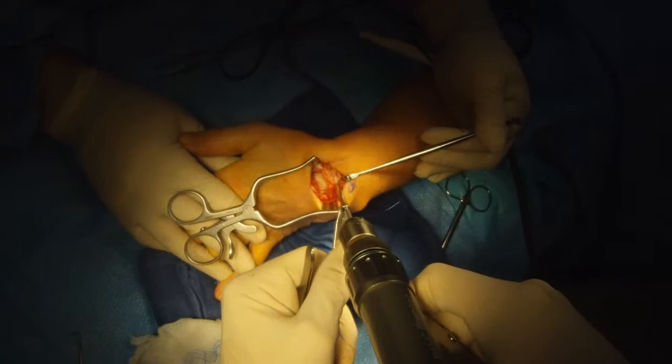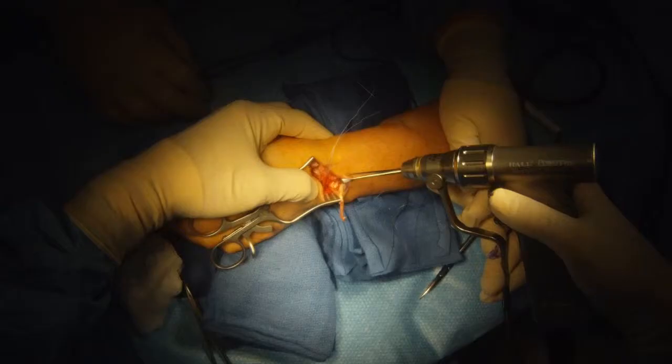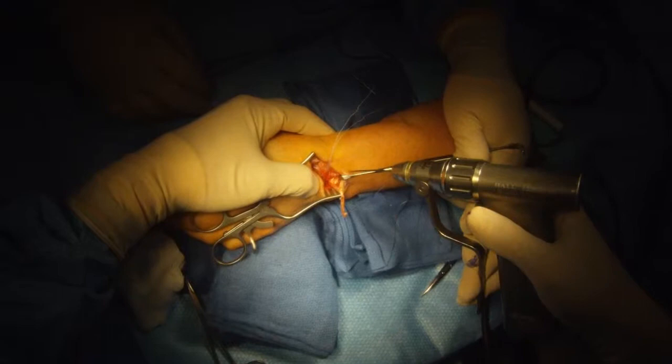Now we're going to place an anchor into the lunate, which we can use to help tie down and tension the tendon graft to reconstruct the scapholunate ligament.